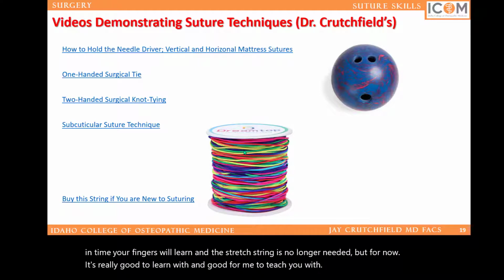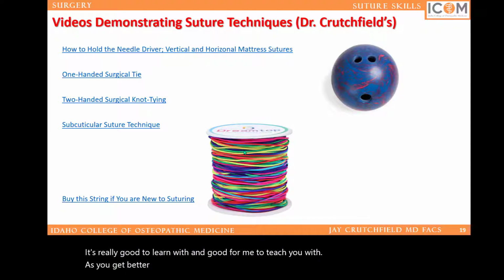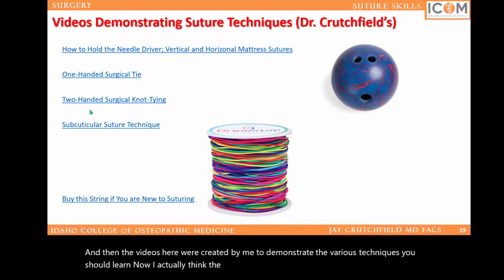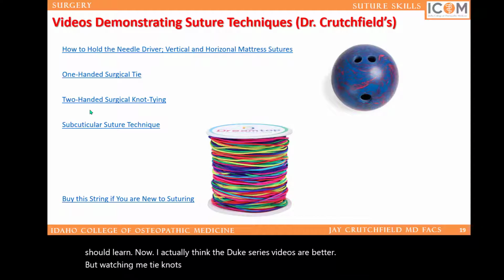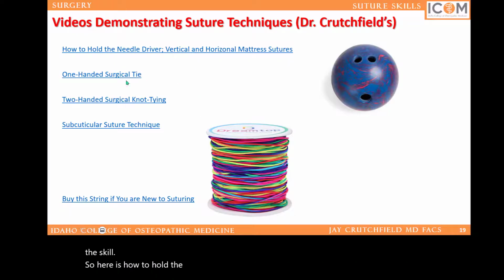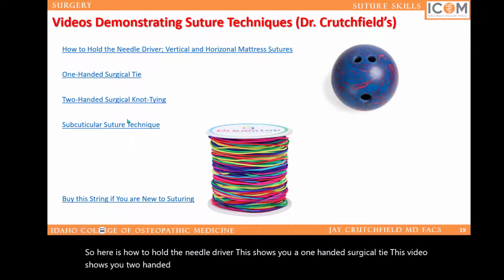As you get better, go buy some kite string. And then the videos here were created by me to demonstrate the various techniques you should learn now. I actually think the Duke series of videos are better, but watching me tie knots might be more useful than watching another surgeon teach you the skill. So here is how to hold the needle driver. This shows you a one-handed surgical tie. This video shows you a two-handed surgical tie. And this video shows you a subcuticular suture technique.